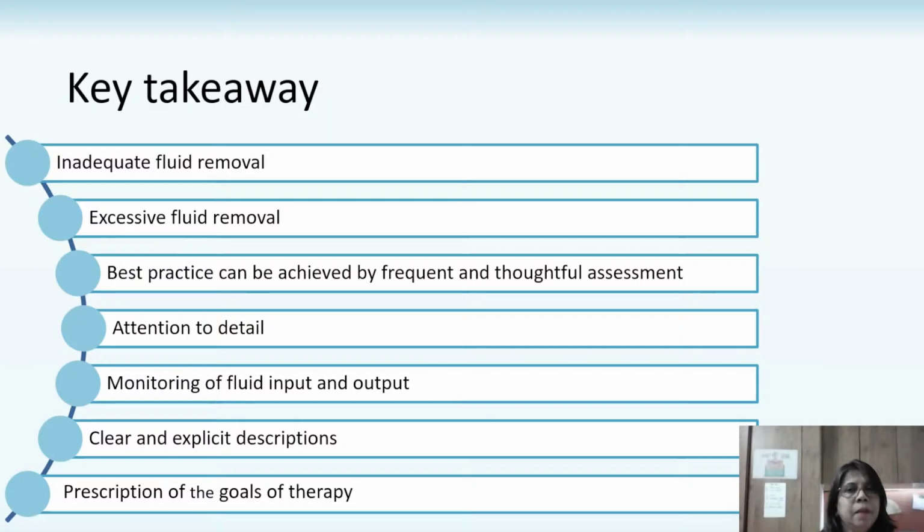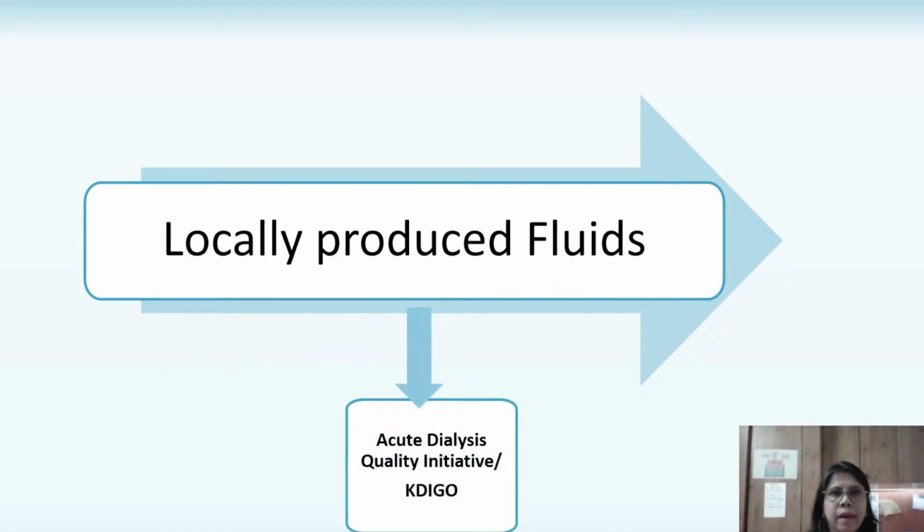The best practice can be achieved by a thoughtful and frequent assessment. Like I said, attention to detail is very important, and monitoring of the patient is very, very essential. If we give clear and explicit instructions and prescriptions of the goals of therapy, then we are sure to have a winner. Let us now understand the fluids that are actually used as replacement or substitution fluids in CRRT.